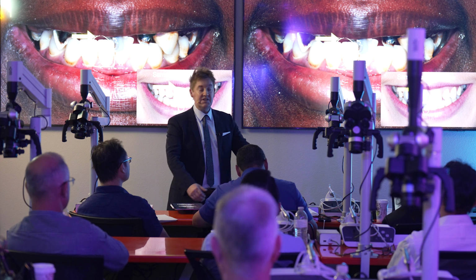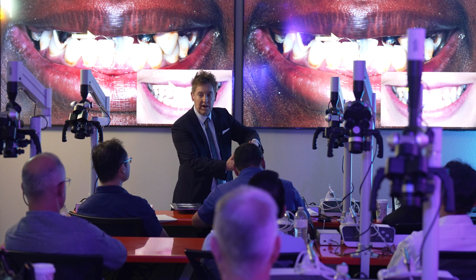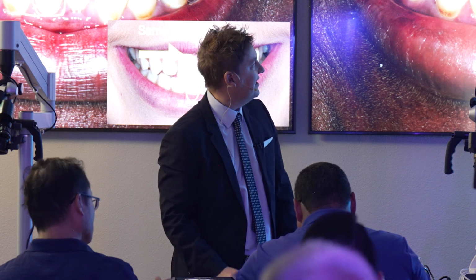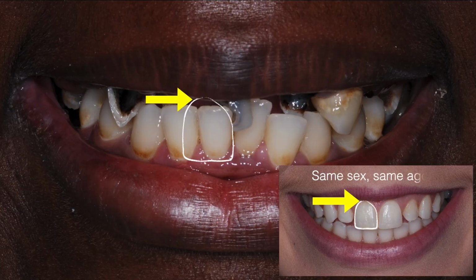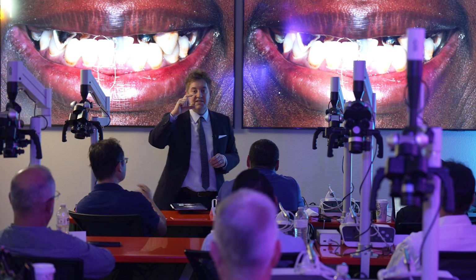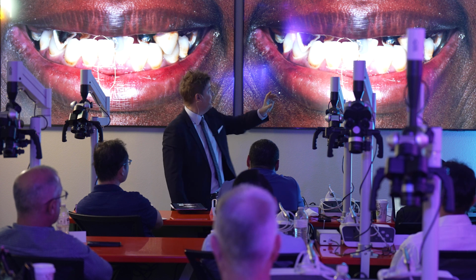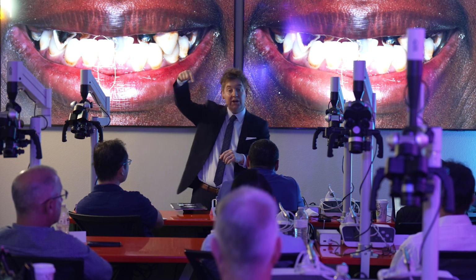Let's draw in our mandibular anterior tooth. We already established that this patient in an ideal scenario has about 2 millimeters of overjet and overbite. Now look at our problem on the maxillary arch. We have 100% overbite, and that's in the anterior. How are we going to fit a prosthetic in the upper arch? Because the face dictates where tooth position goes, which is the start of all of our treatment plans. Now, we know that that prosthetic needs a certain amount of space, but it starts by establishing incisal edge position in the patient's face and working apically.